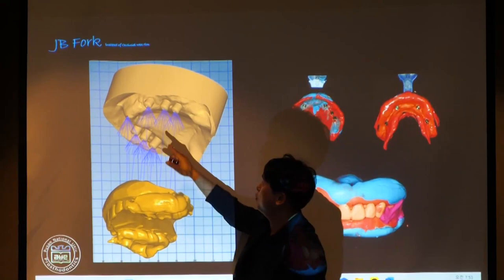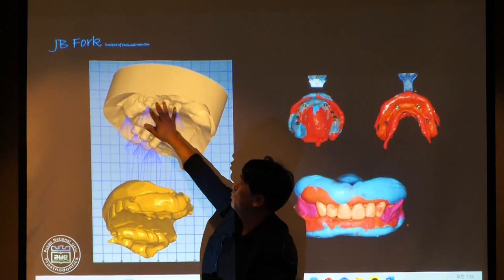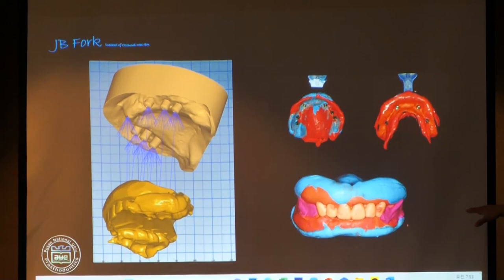If you click elsewhere, this will be different. So be careful. Anyway, every reference will be located on the crestal ridge. Okay? So with the upper and lower impression and then the JB fork, we can get the position of the anterior teeth directly.